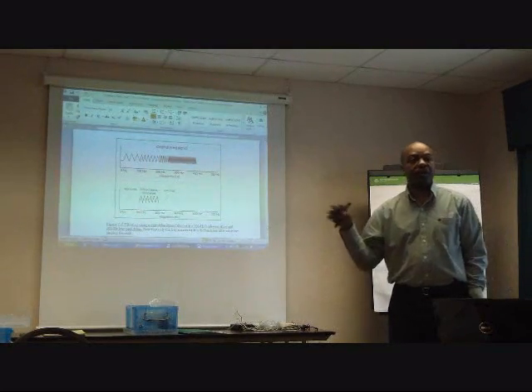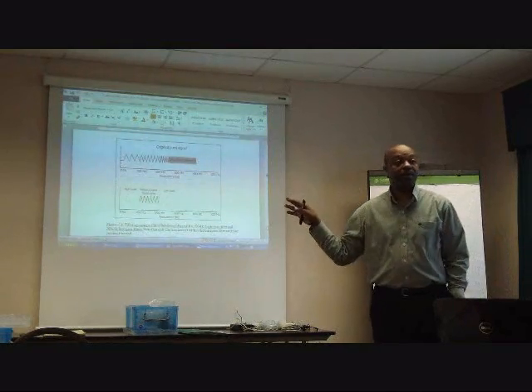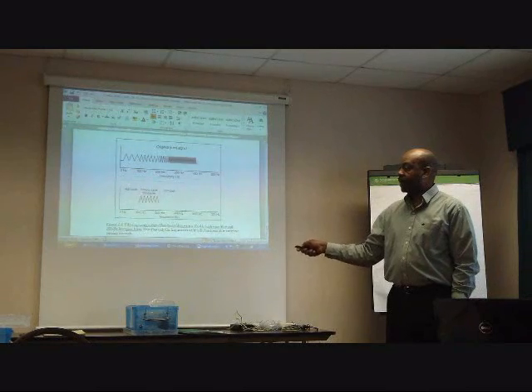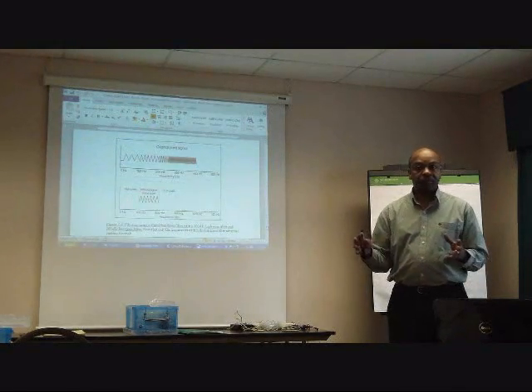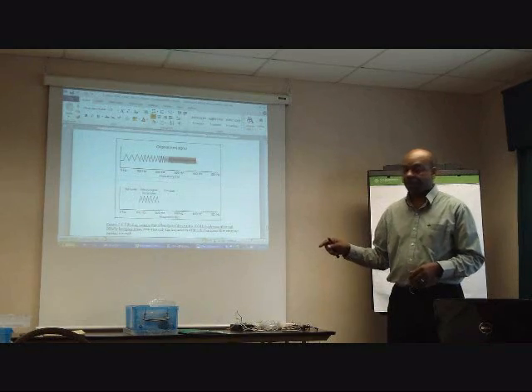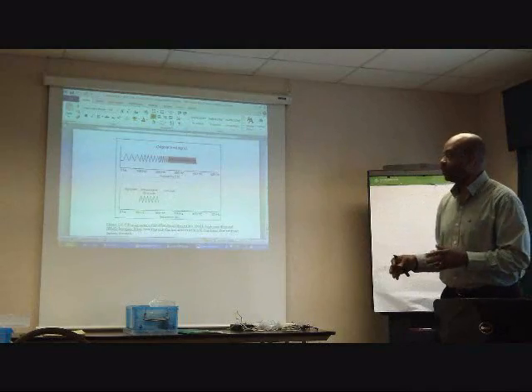So if I see a reading on the screen, when we're measuring the EMG, if I see a reading of 3 microvolts, that means that's the average of the activity within this range. Okay? Now, microvolts is how much power there is. The frequency is hertz. That's how many cycles per second. So they're two different things. Sometimes people get them confused, but they're two different things.